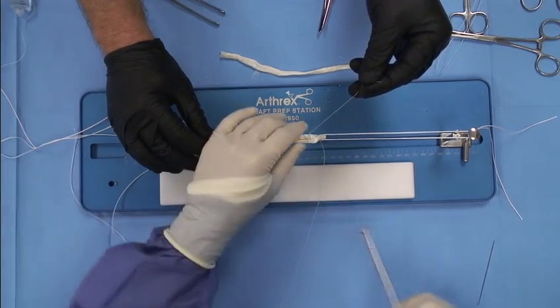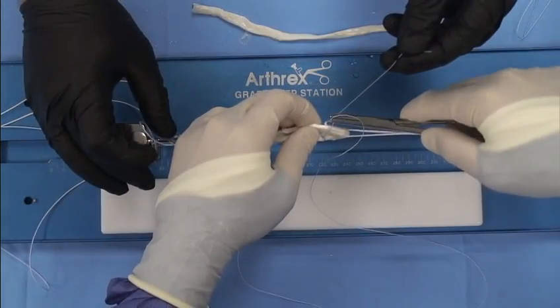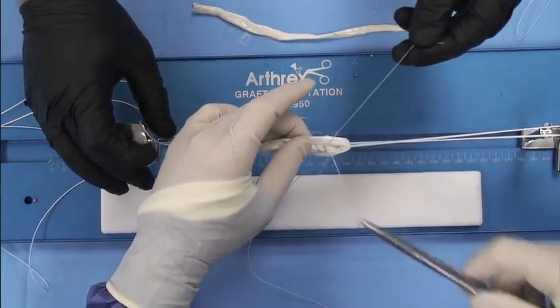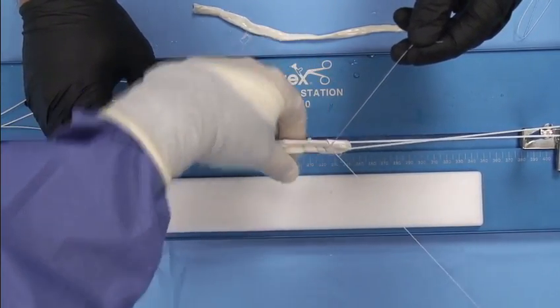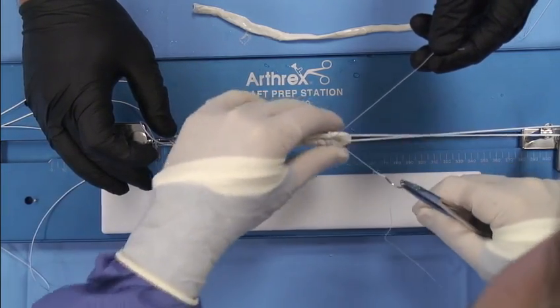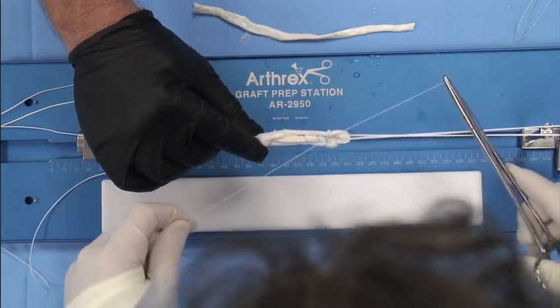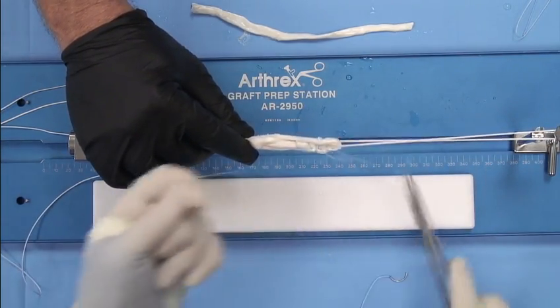And now I've gone through three of the strands. I'm going to come back through my number one. And by doing so, you can see I'm creating a buried knot technique. So this is O fiber wire with a buried knot, and it's very small at the end of the day so you don't have it become bulky when you place it in your socket.